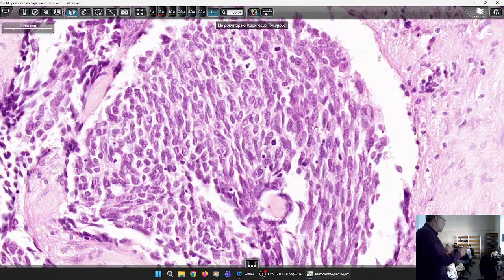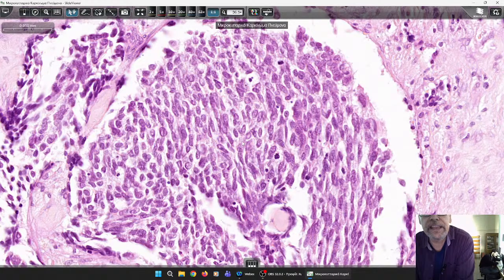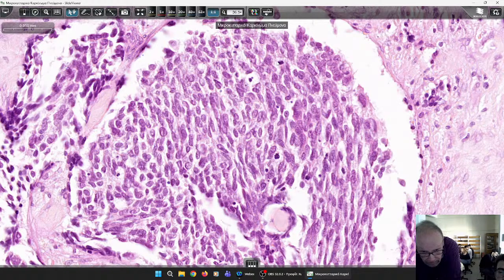manageable by chemotherapy. And what else is related to this increased Ki67 index? Look, what is this? And this here. Look, how has the nucleus been transformed? What is this here? See? It is hyperchromatic, but also it's mitosis. So it will have increased mitotic activity, and this is another mitosis. You see here how irregular the contour of the mitotic cells are.